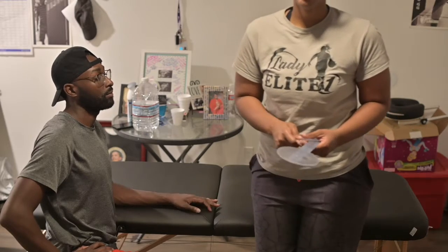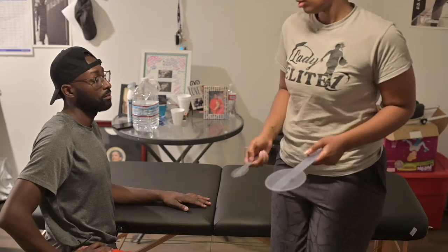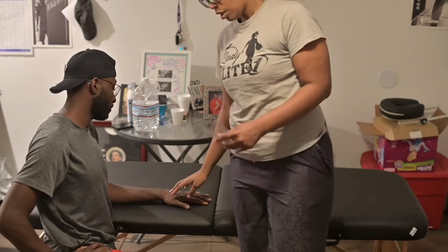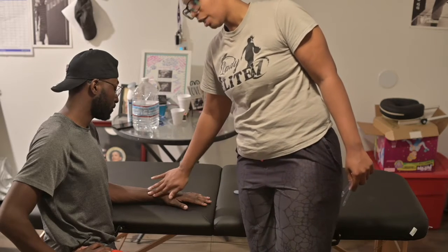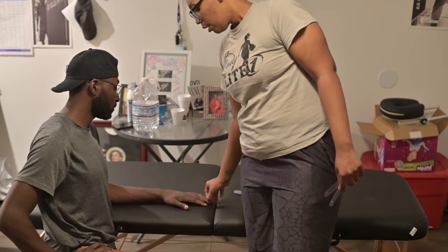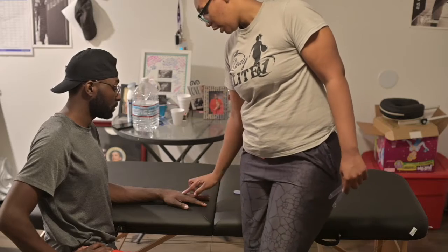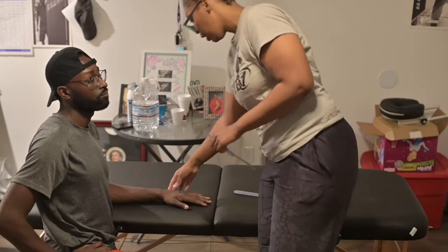Also, the landmark to palpate for would be the capitate, which is one of the carpal bones. Also, we're going to use a small goniometer to measure range of motion, and the average range of motion for radial deviation is 20 degrees. The stationary arm will bisect the ulna and the radius, and the capitate sits right about here. The mobile arm will be aligned over the third metacarpal. So again, axis of rotation at the capitate.